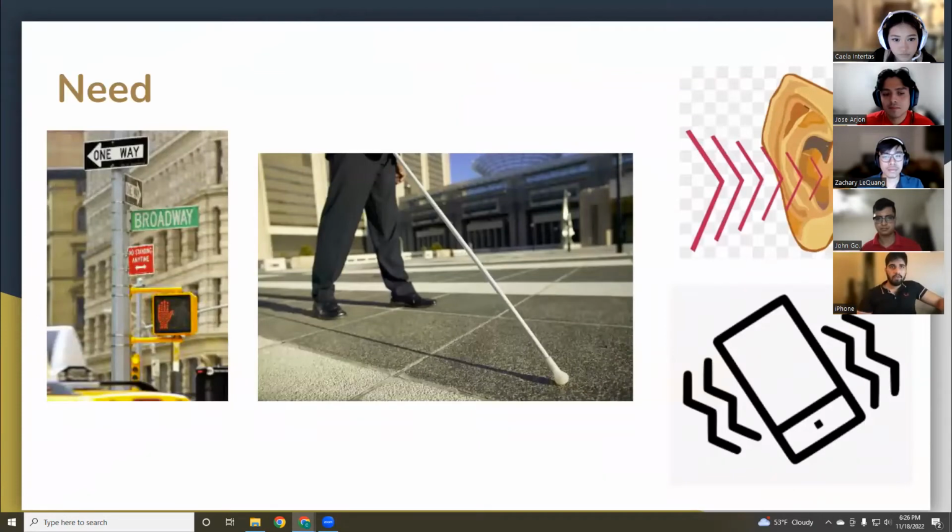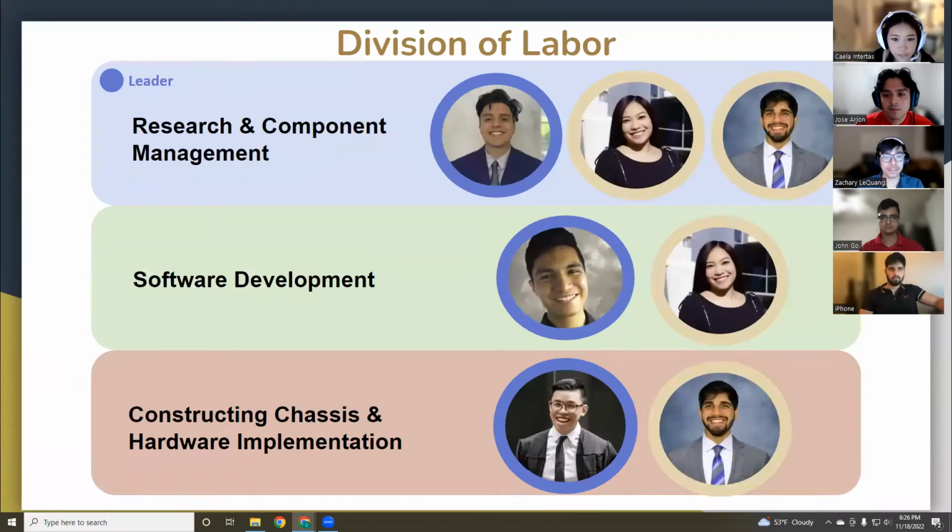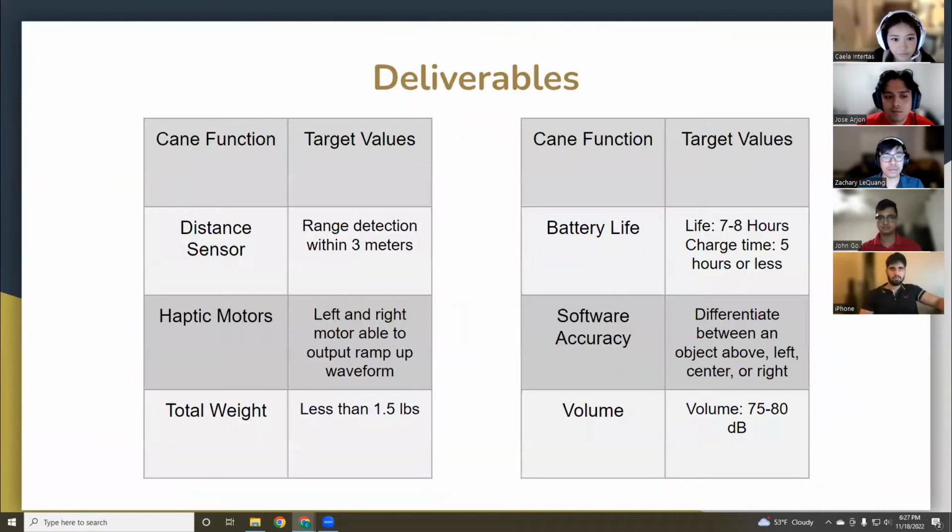What we need to solve this issue is to first investigate the techniques used by visually impaired to use the white cane and to look at which objects and structures most cause the injuries. So the goal of this project was to develop a smart cane that detects objects above the waist level to improve the safety of a traditional white cane by notifying the users of objects ahead of time. And in order to develop the smart cane, each team member was placed into specific tasks based on their cultivated skills and past professional experiences to really maximize the effort put into the cane.